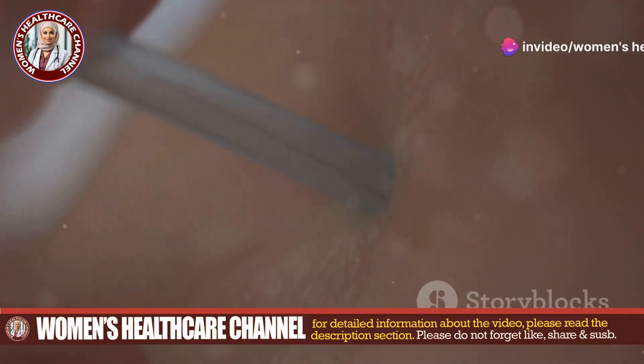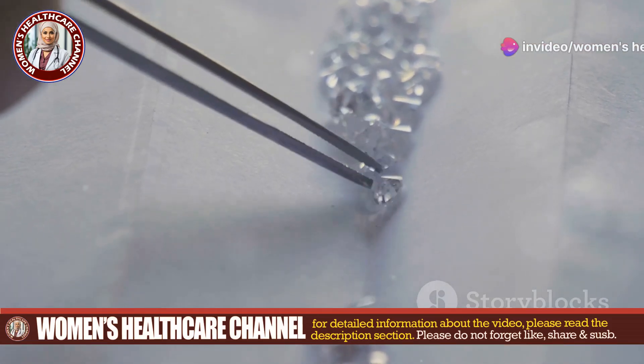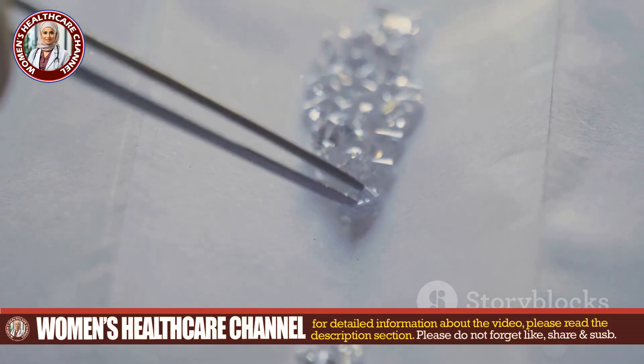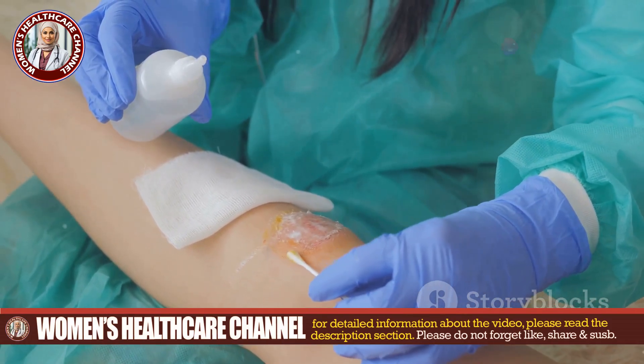Now, carefully enlarge the larva's breathing hole with a small needle if needed. Using sterile tweezers, grasp the larva by its head and pull it out slowly and steadily. After extraction, clean the wound thoroughly with antiseptic and cover it with sterile gauze.